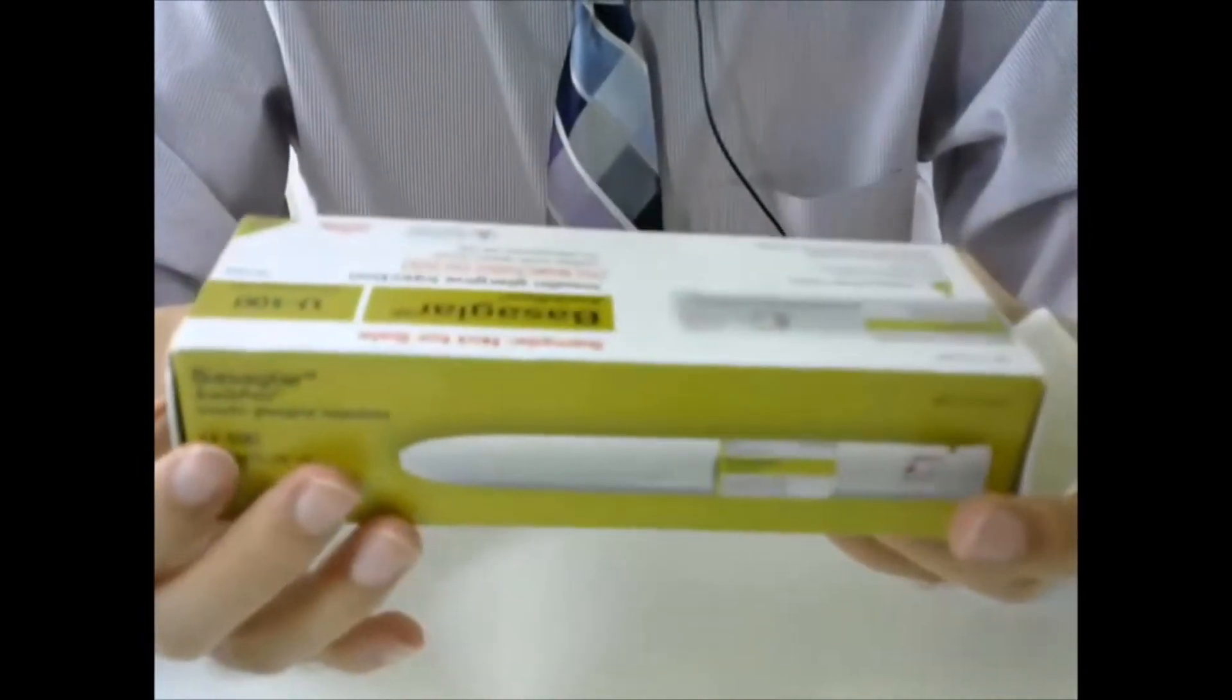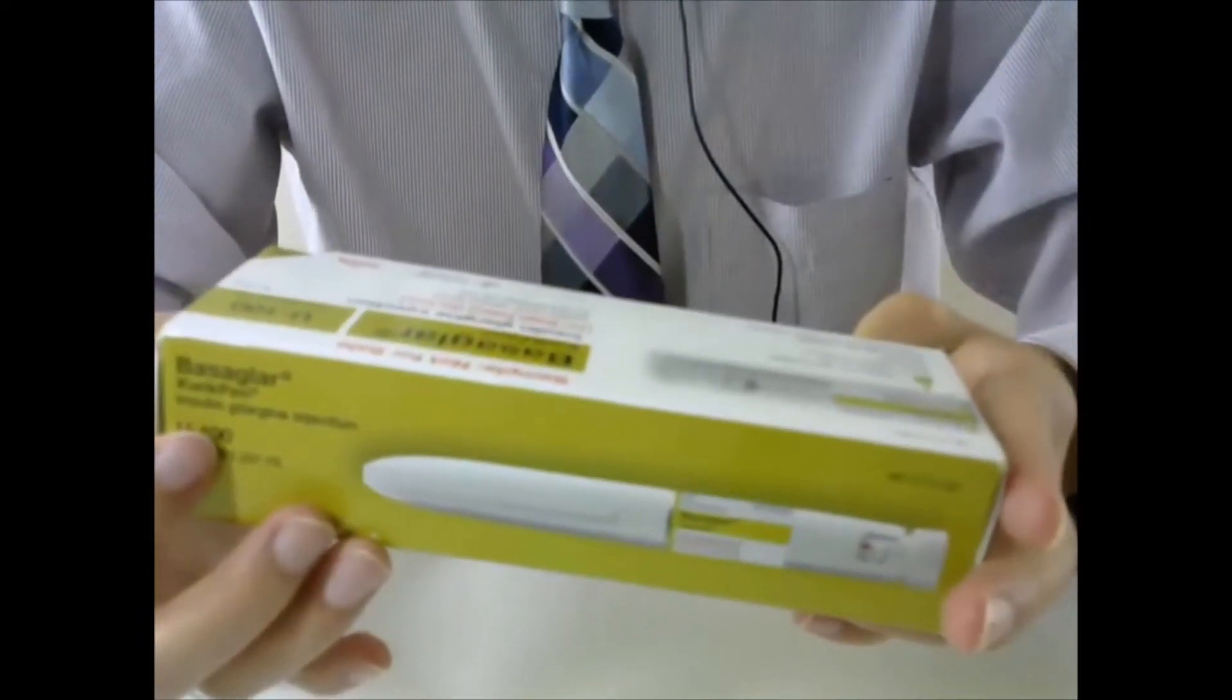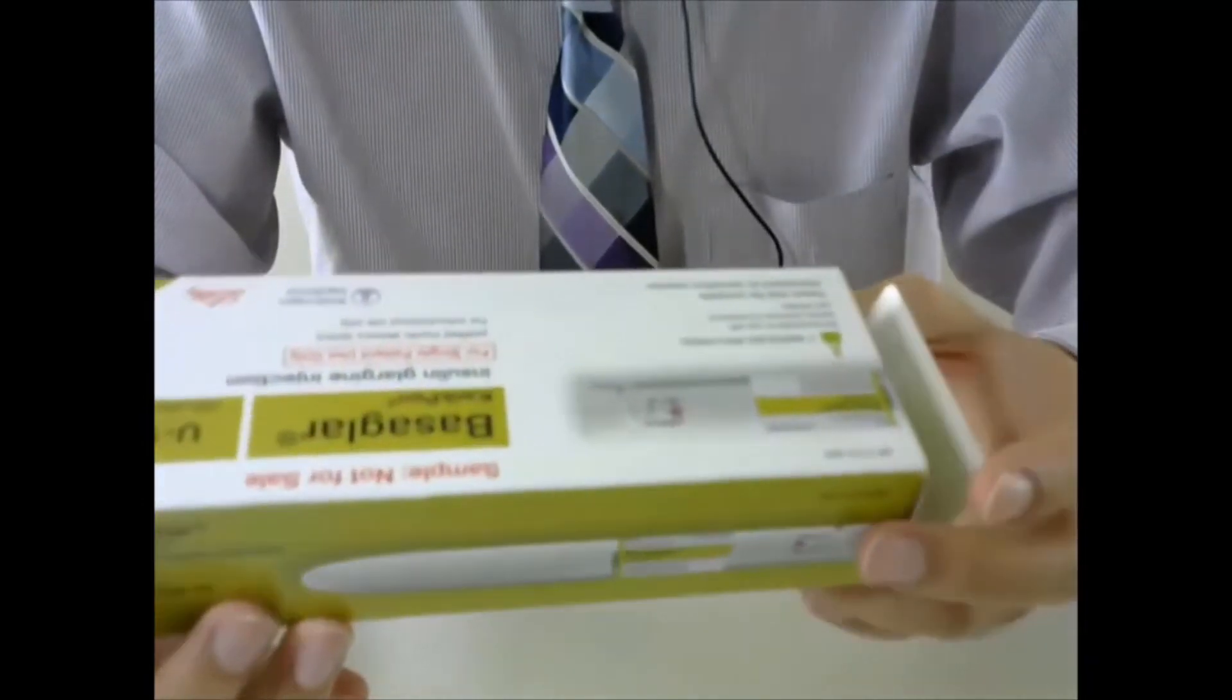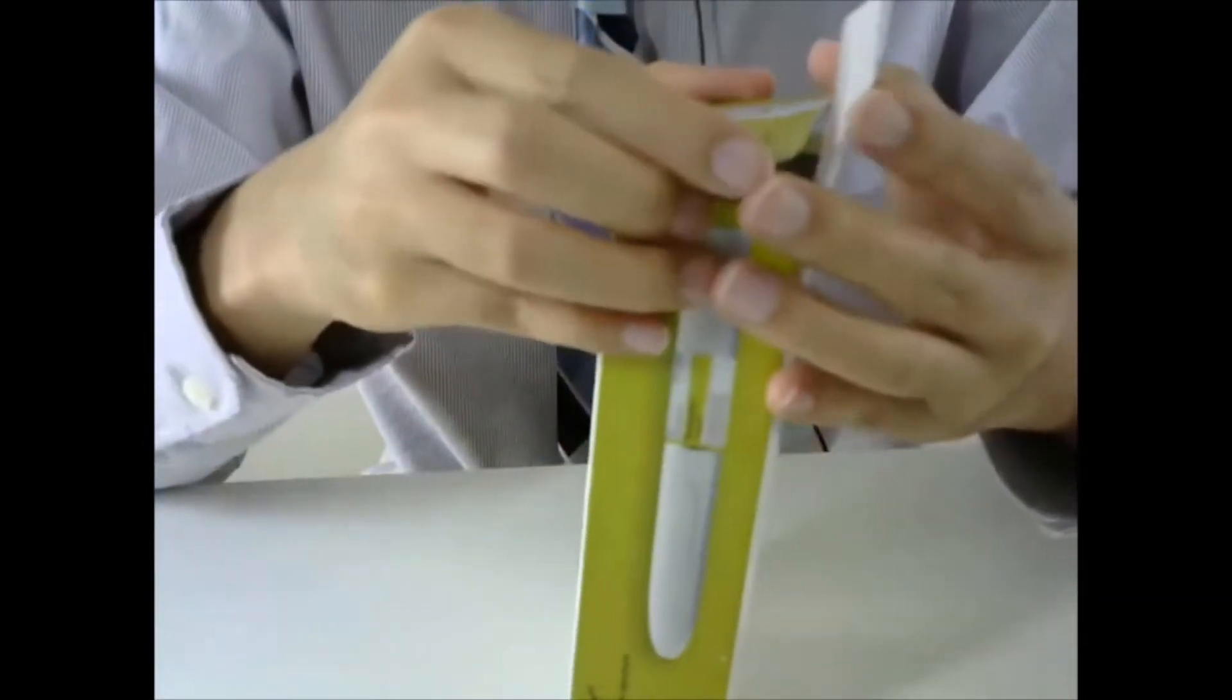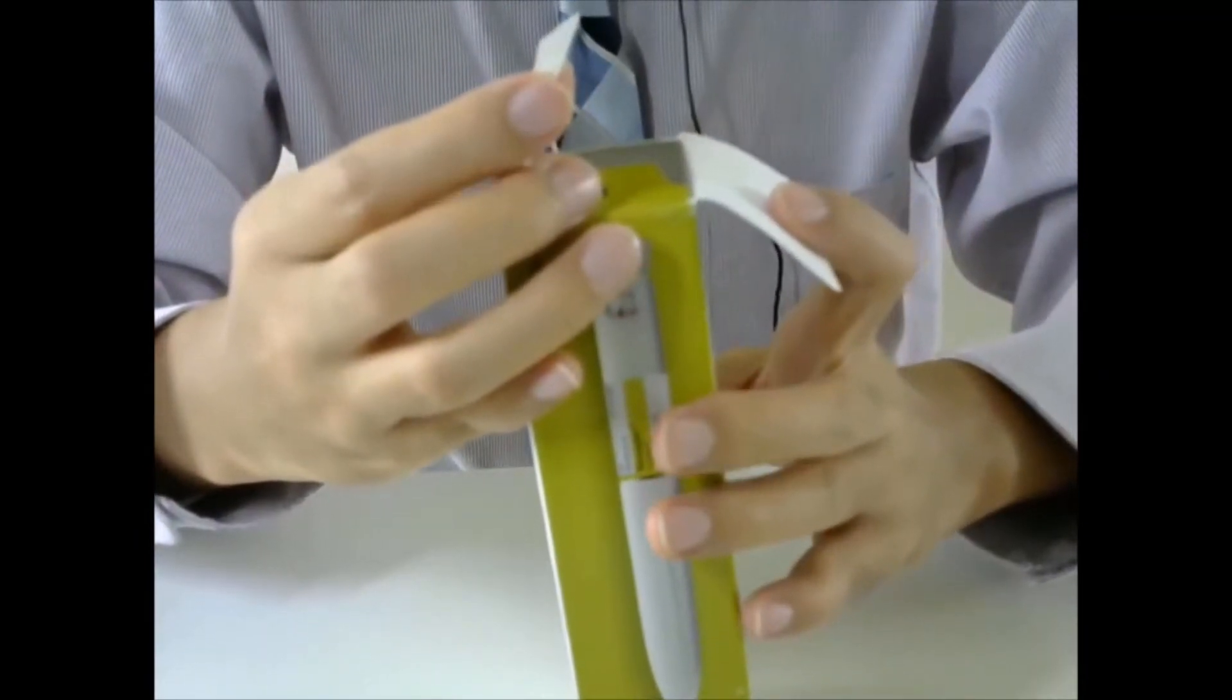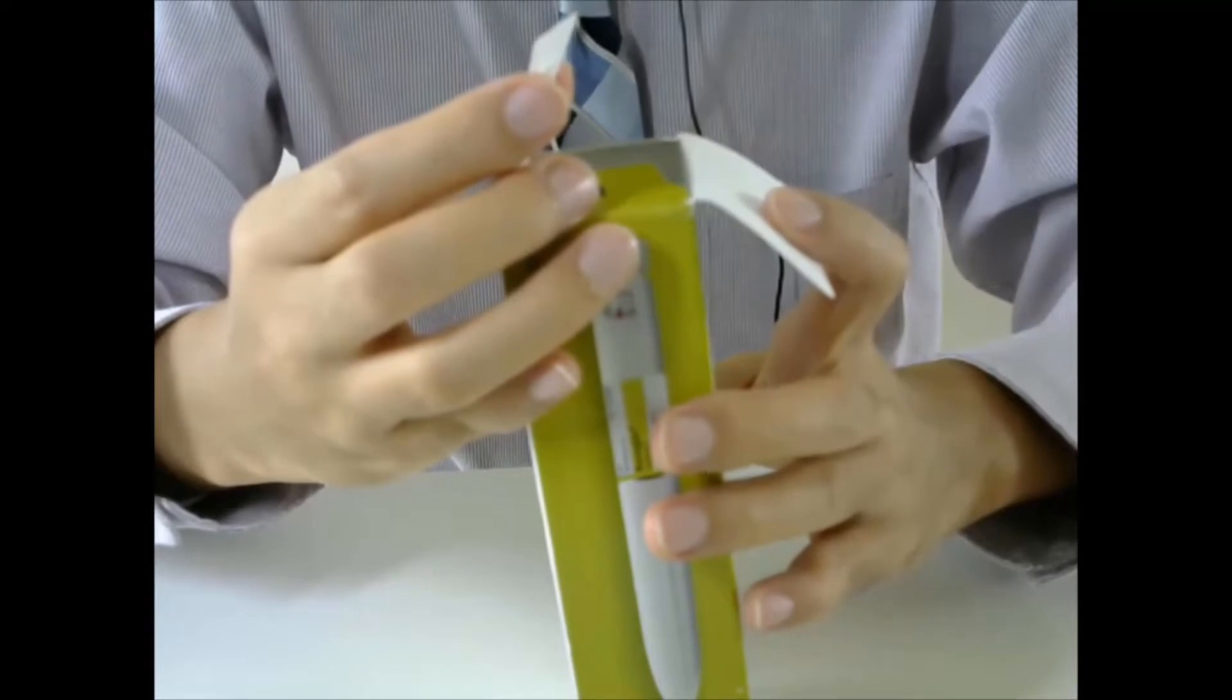You should always store the insulin in the fridge, but not in the freezer. Once you start to use a pen, you should keep it at room temperature and toss it in 28 days.